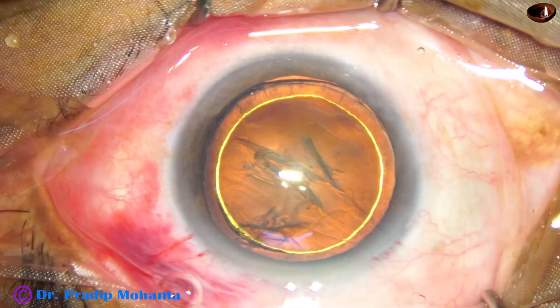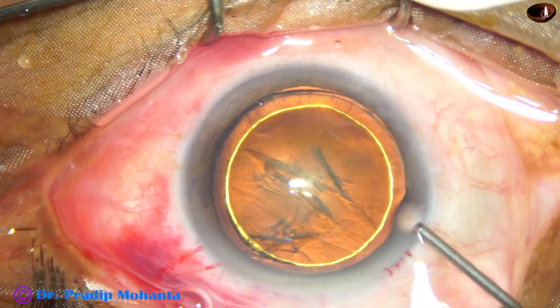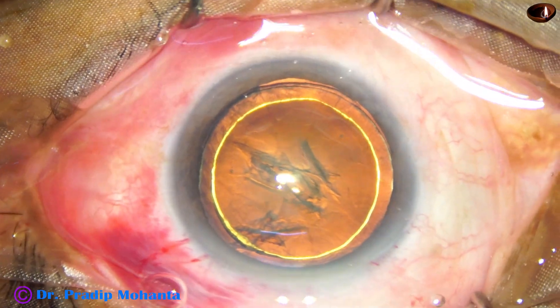Hydrodissection and hydrodelineation is done. In this case, hydrodelineation has produced a beautiful golden ring.